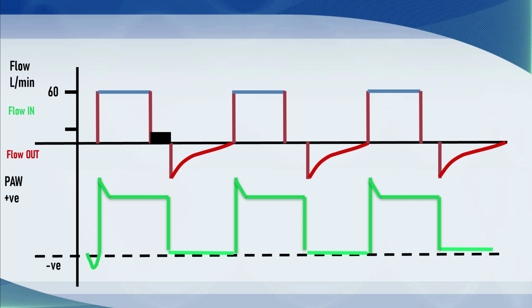You can see that little gap there between the inspiratory part of the flow waveform and the expiratory part. So between the blue flat line and the squiggly red line, there is a gap between one ending and one starting. That means there must be an inspiratory pause or inspiratory hold. As a result, the pressure waveform looks a bit different. This is no shark's fin.